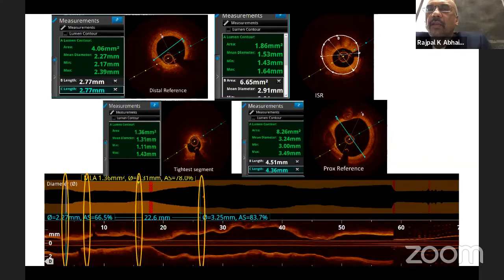Absolutely. Wonderful. There is also something to comment on in your view, even in these cross-sectional views, you have some microcalcifications. You can see that throughout the vessel. Sometimes when those ones are very deep, the OCT doesn't have the penetration to be able to see them, and those may have been the reason why you couldn't get perfect apposition between the old stent and the new stent as well. Sometimes seeing those calcifications after post-PCI is quite difficult, so that may have been a factor as well.